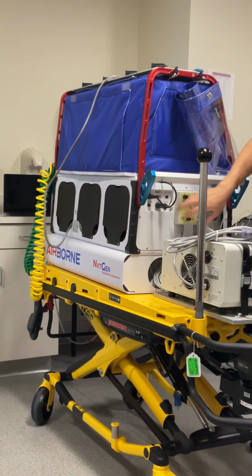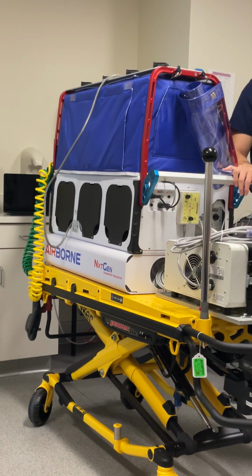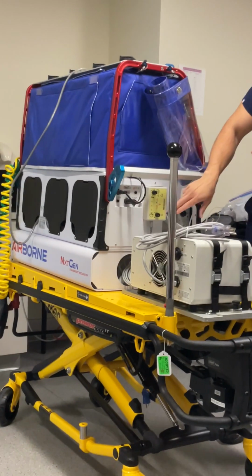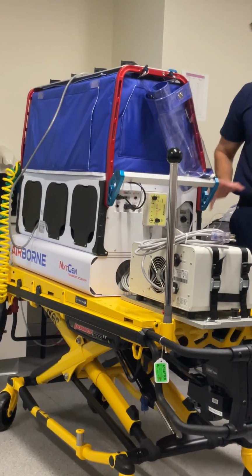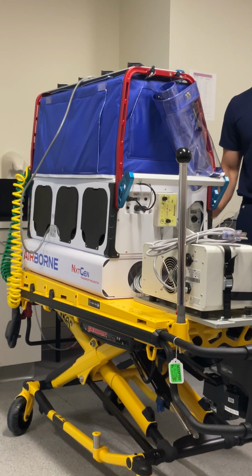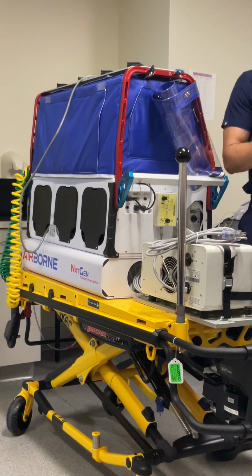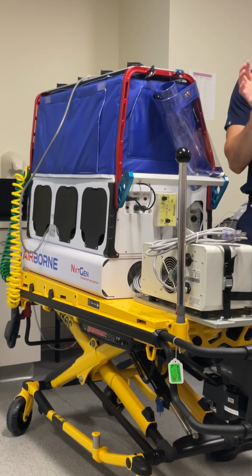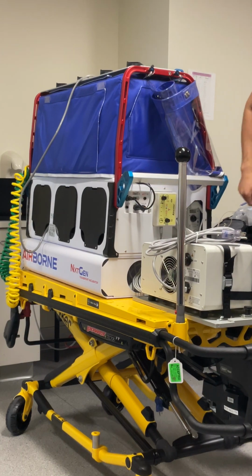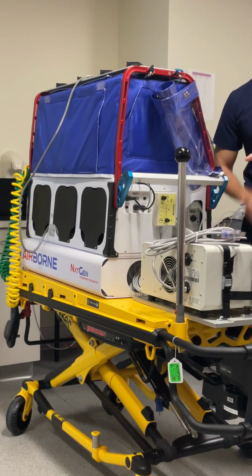This left side. It's important to remember, when he talks about his Zoll, that it's separate patient monitoring than what I'm talking about. So there's a Masimo here. That's for just the central incubator. So that's its own vital sign. Technically, it's just a secondary, or if you're doing a pre and post, but it's 2 different monitors. Does that make sense? So that's where you would plug that in. And they're different cords, just so you know. Yeah, because we love making your life easy.